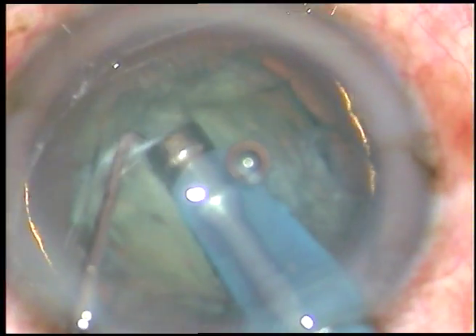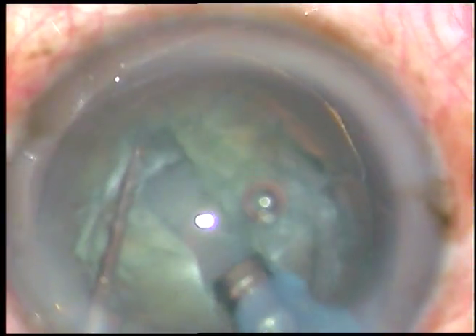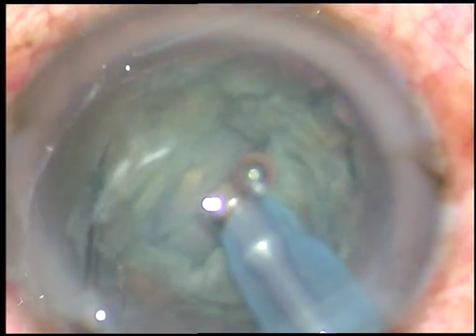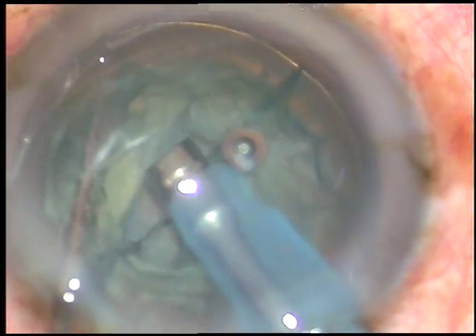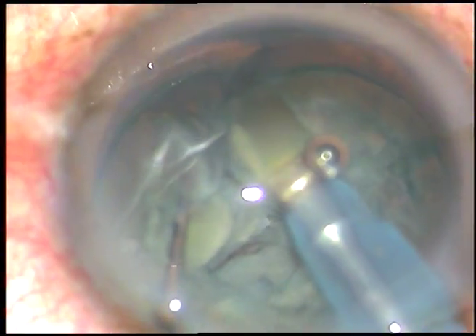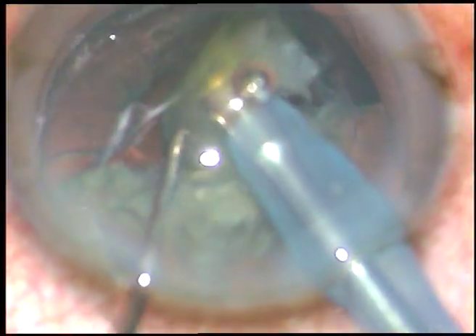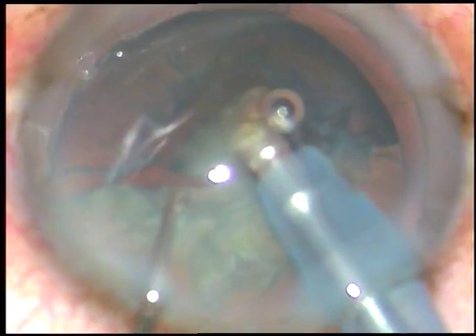Now rotate it 180 degrees to work on the side which was just in front of the main incision. And as you have gone to sufficient depth, apply opposite forces and divide the nucleus into two hemi-nuclei. Now each hemi-nucleus is held with vacuum and it is chopped.